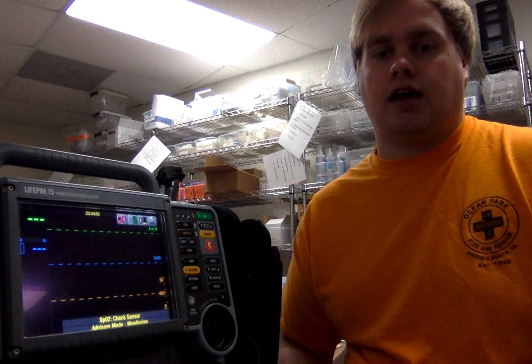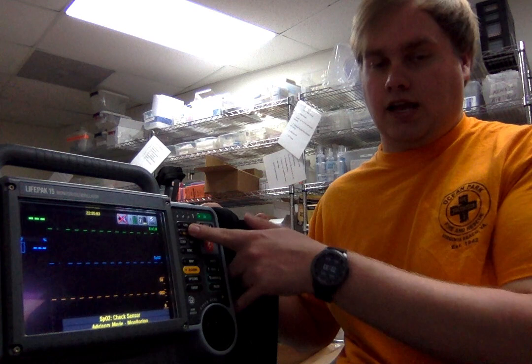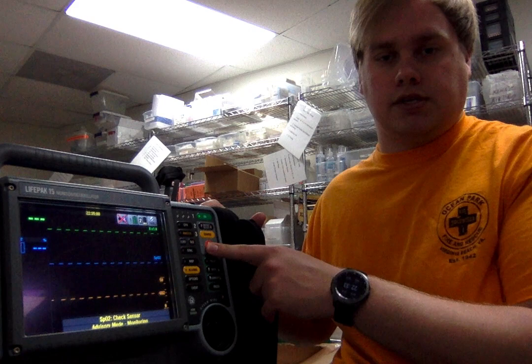It has multiple options and the price varies based off of what you want to include with your module. To start out with the basic, you can have an AED which is attached to this side. If you would like to put it in AED mode, you can just hit the Analyze button and it will analyze just like an AED, and then you can deliver your shock by pressing this button.